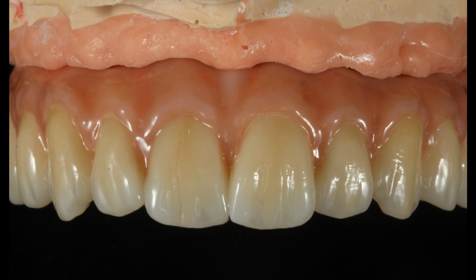This is customized zirconium by layering porcelain over the front of the teeth. You'll notice translucency. Natural teeth all have translucency. In some patients it's easier to see than others, but if you'll notice these little subtle areas of translucency, they diffract light differently than solid monochromatic teeth.